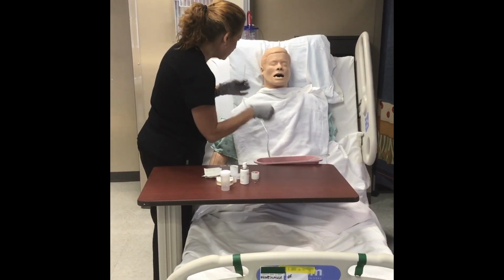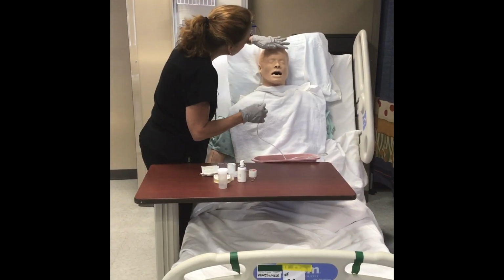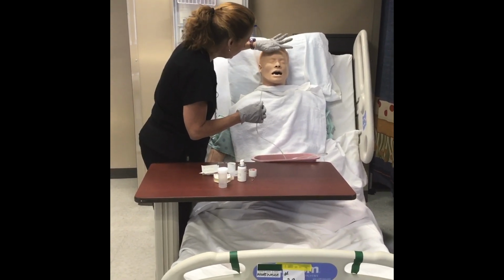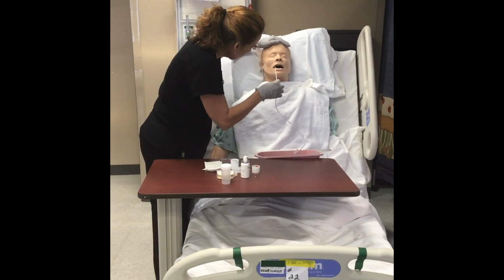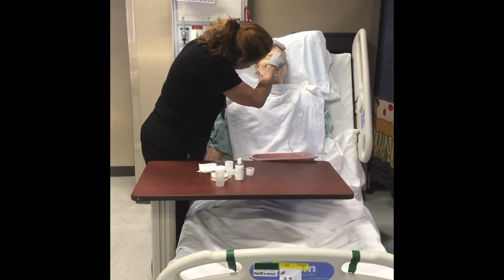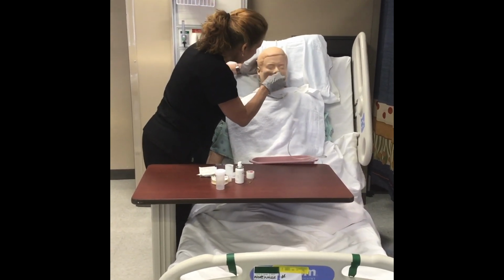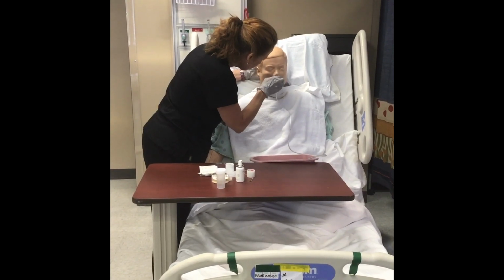Okay, I'm ready to proceed. Are you ready to proceed? Yes. Okay, now what I want you to do first is I want you to tilt your head back against the pillow. And I'm going to go at a horizontal to the top of the throat. Okay, now when you start gagging, swallow for me, please.